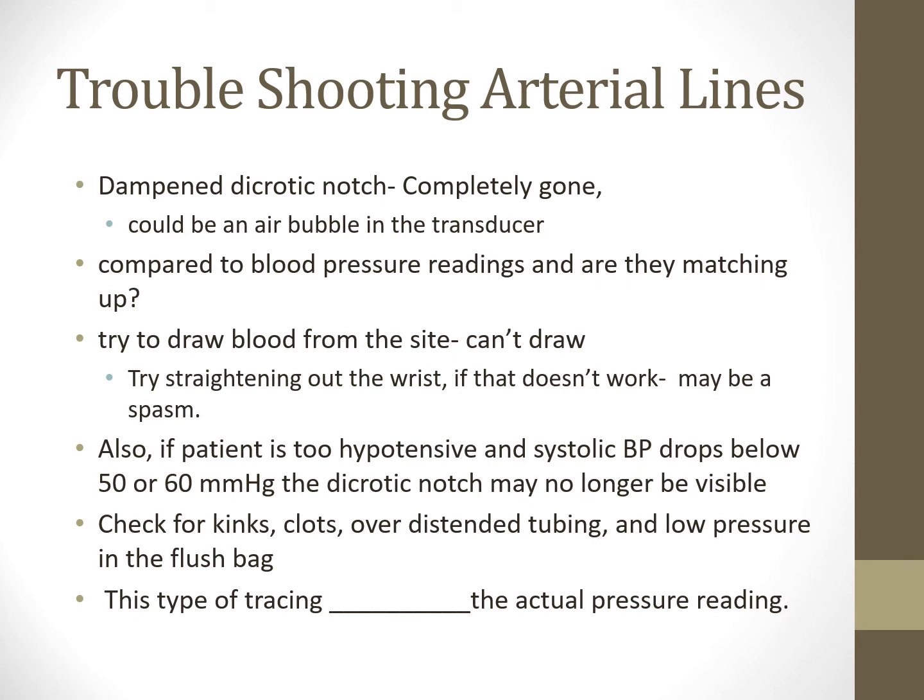Compared to blood pressure readings, are they matching up? So this is what I was talking about before. Run a manual, right? You see something weird on the arterial line, run a manual. Compare the two. Is this an accurate number that we're seeing? Before we start pushing drugs or fluids or anything like that, before we start treating this, let's just verify that it's real first.